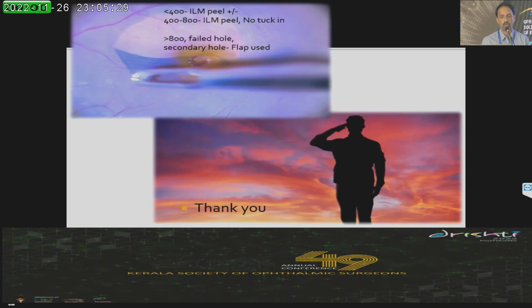So to conclude, for any hole which is less than 400 microns, an ILM peeling is not really necessary. Between 400 to 800 microns, I would definitely peel the ILM. And for those which are more than 800 microns, failed holes, or secondary holes, I would definitely use a flap-based technique, either tucking in or a temporal flap or one of these modifications.